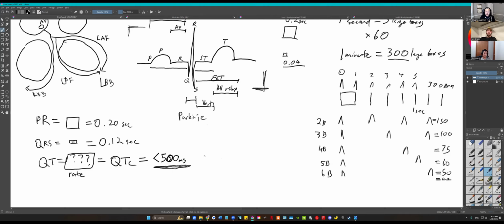All right. The other thing is if this is the QRS, my shorthand QRS spike, and this is the T wave, and the machine, for whatever reason, isn't giving you a QTc, the T wave has to be shorter than the midpoint from spike to spike.